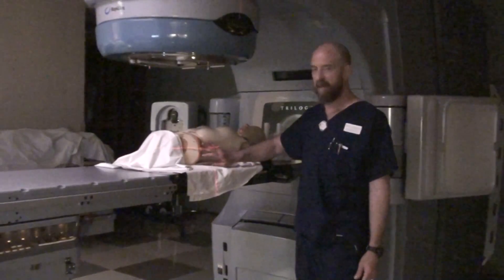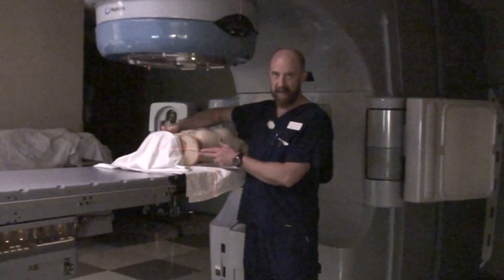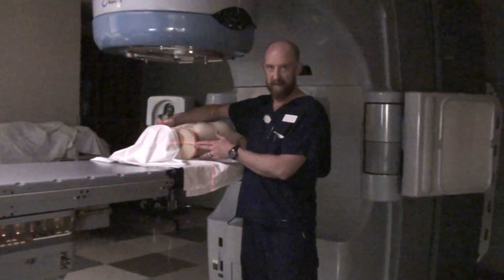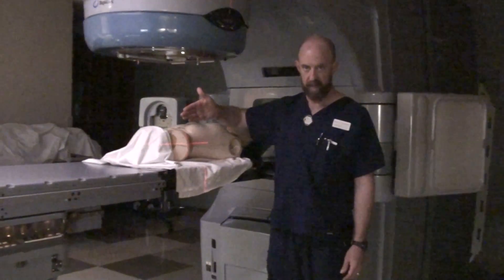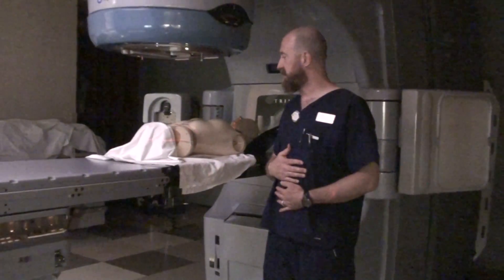So what we're going to do is use our lateral marks on the pelvis to get left/right, in/out, and up/down — and then we're going to use the anterior mark for left/right only.